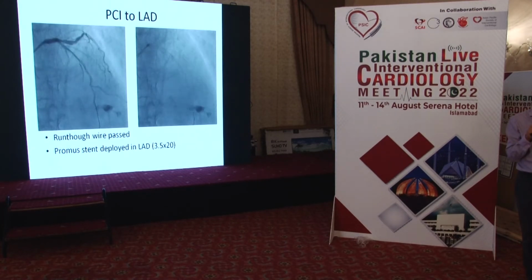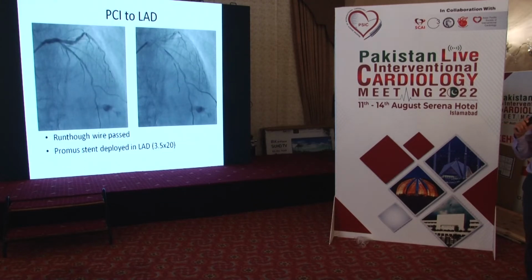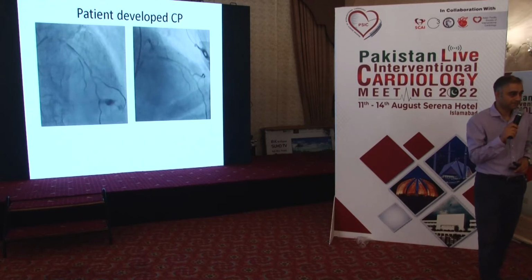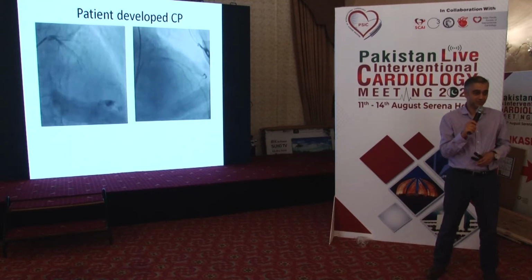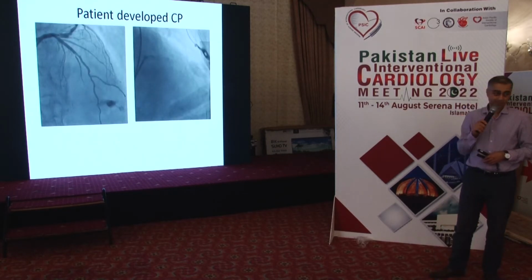Yeah, slightly slow flow. Why do you think? Yeah, it could be thrombus that's moved on. Can I have the next slide, please? Yep. So it could be dissection. Yeah. So what happens then is you can see this guy's clutching his chest, and when you see that, it's always a bad sign. It means something is going on. He's getting chest pain. And my feeling was this was probably an edge dissection.